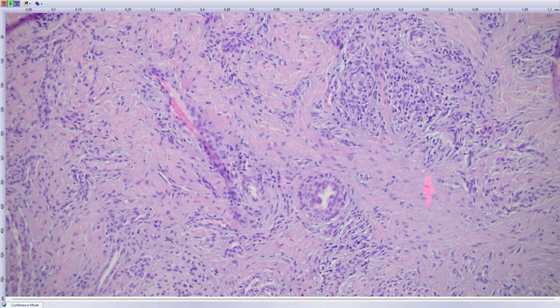We did molecular genetics and we found that the tumor is KIT mutated. We further tried melanocytic markers, but they were all positive. Yeah, that was HMB45 positive, Melan-A protein positive, SOX10 positive. So that it's a pigmented lesion.